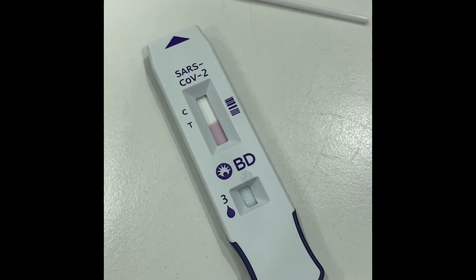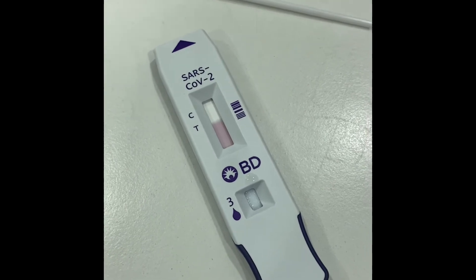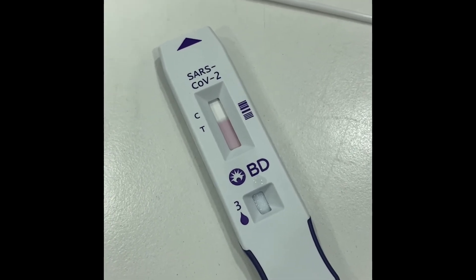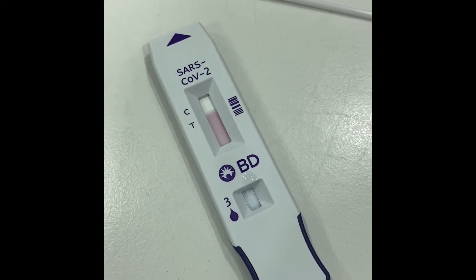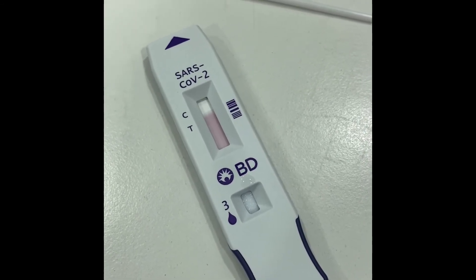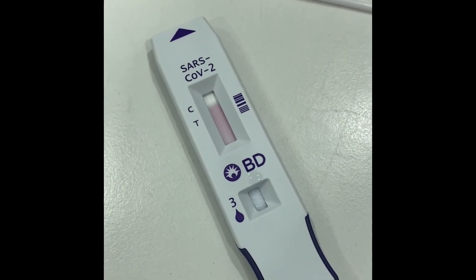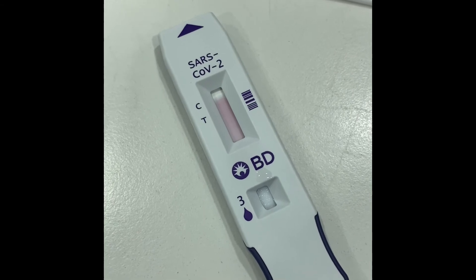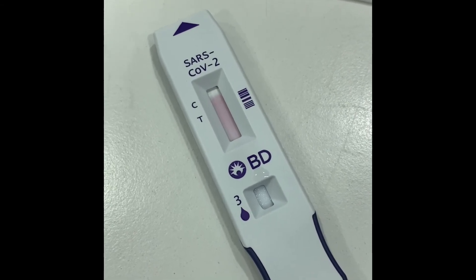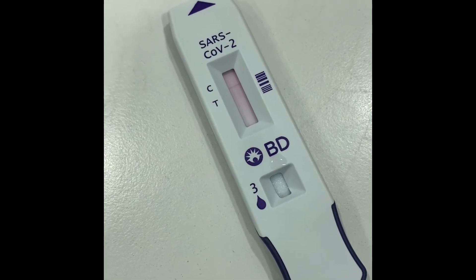To get the exact result, you have to wait about 10 to 15 minutes. While you are waiting, slowly the red color line will appear. If you see a line appearing at both the C and T position, the result will be positive. If you see the line appearing at C only, then your result is negative.